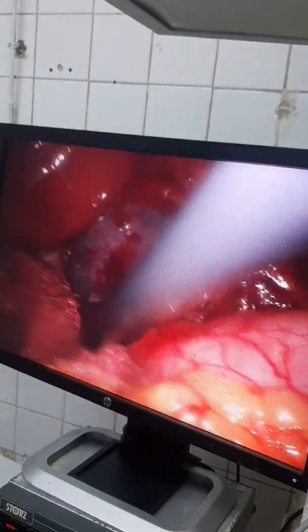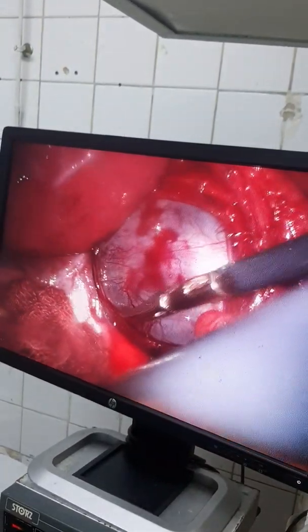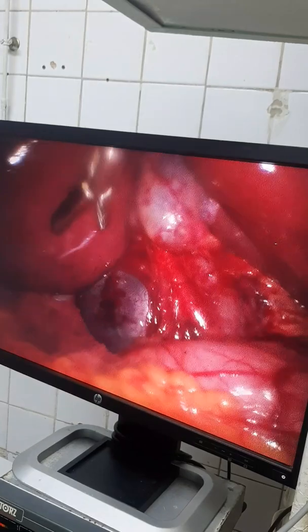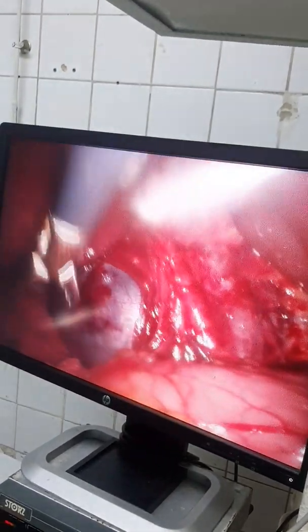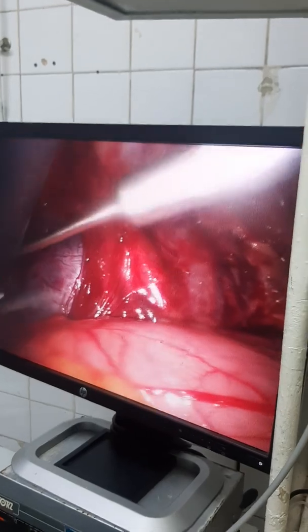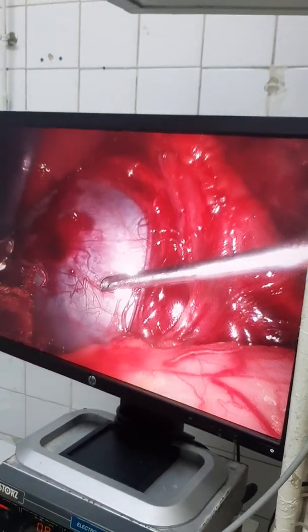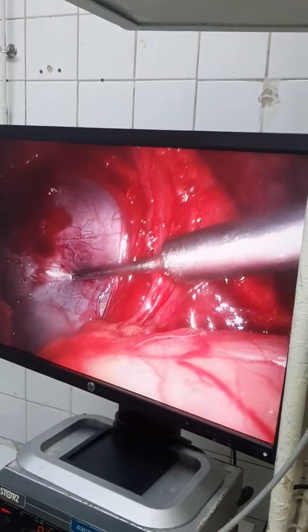We will do aspiration of the cyst to see the nature of the cyst and to deal with it. We will put gauze around the cyst, and if there is spillage, we will do gentle suction.